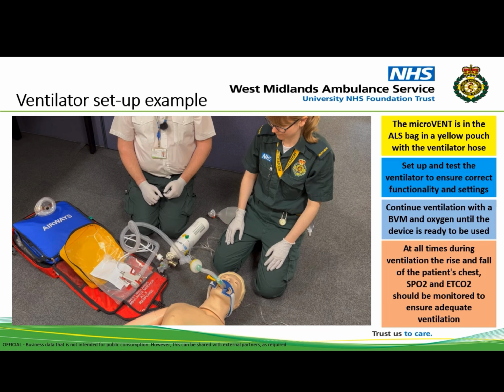Ensure there is always a bag valve mask available with the patient in case of ventilator failure, so that ventilation can be taken over using the bag valve mask until the problem is resolved.